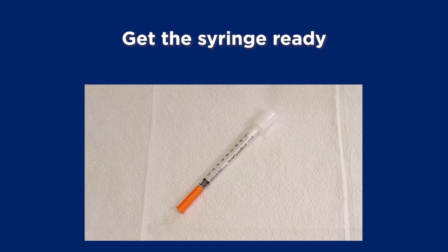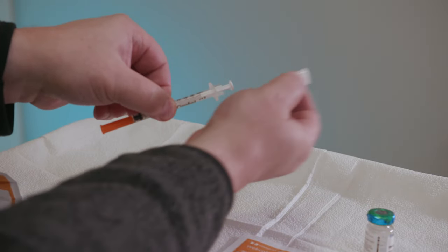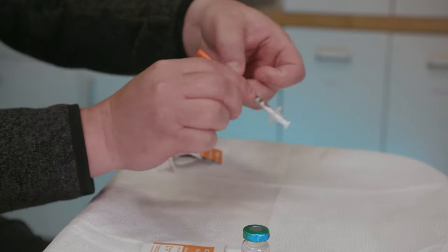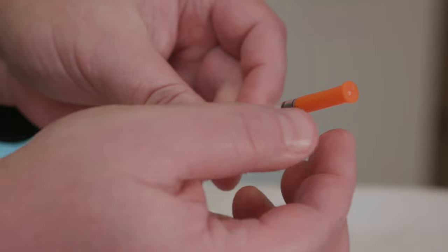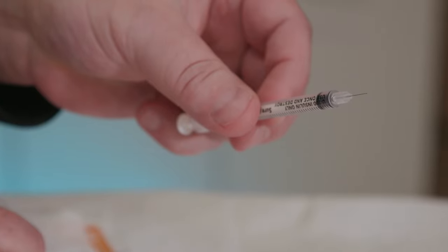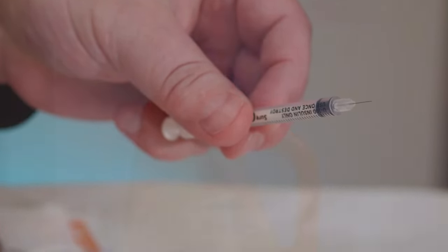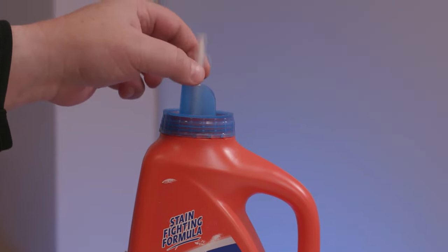Next, get the syringe ready. If there's a cap covering the plunger, take it off. Then, take off the orange cap covering the needle. Be very careful not to let anything touch the needle. If anything does touch it, put the syringe in your sharps container and use a new one.